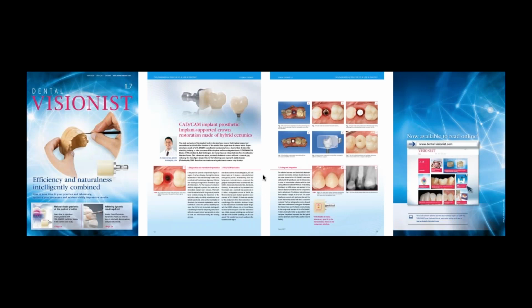Okay, I also published in Dental Visionist, which is the journal from VITA, on CAD/CAM implant prosthetic, implant-supported crown restoration made of hybrid ceramics. And basically, when we are thinking about practical step-by-steps, the first thing I do when I'm going to make the intraoral scan, I will remove the provisional restoration or the healing abutment and scan the soft tissue, okay? That will always be my first scan.